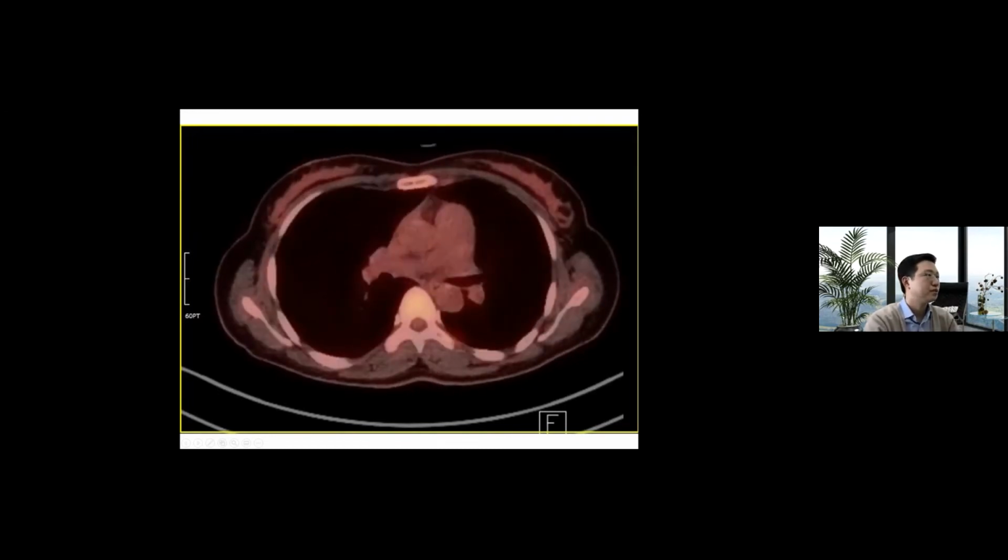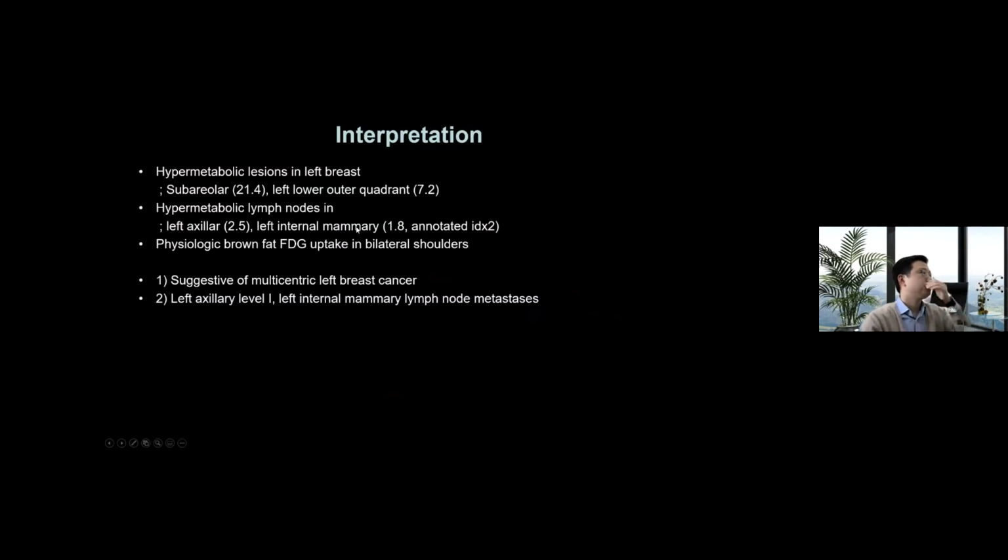So the interpretation will be multifocal, multicentric left breast cancer with suspicious lymph node metastasis in axillary and internal mammary nodes. This should be confirmed by a biopsy to do the accurate staging.